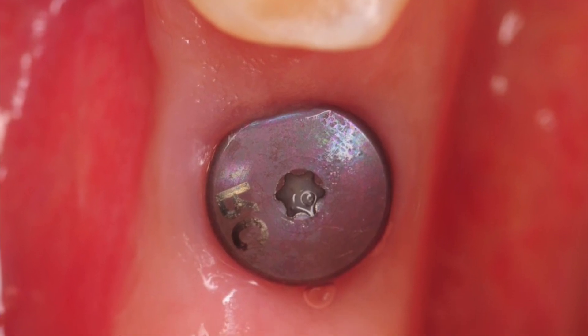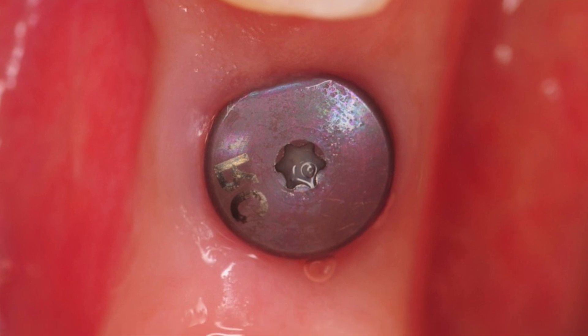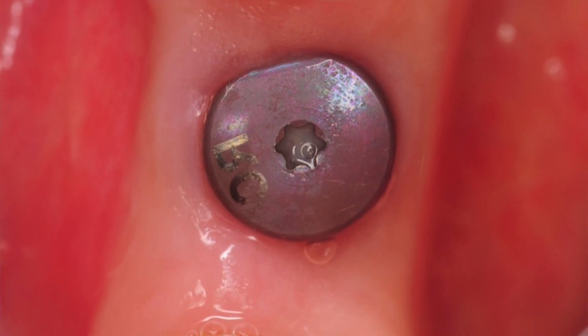There are two types of healing abutments commonly used. The first is called a stock healing abutment, which is a factory-designed and fabricated component. It's typically a cylindrical or conical shape made of titanium. It protrudes above the gum line just slightly and is generally left in place for a few weeks or months to allow the gum tissue to heal around it.